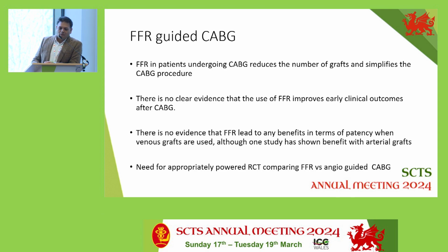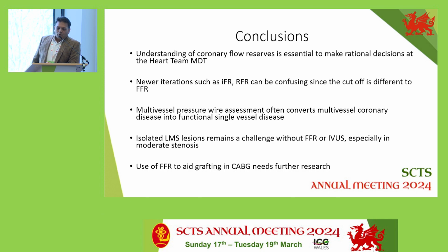It is agreed that there is a need for appropriately powered randomized studies looking at FFR versus angio-guided CABG. So to conclude, our understanding of coronary flow reserve is essential to make rational decisions at the heart team MDT. It will be increasingly the case that these cases will be discussed at the MDT, and as a surgeon I think it is important to have a knowledge of this.